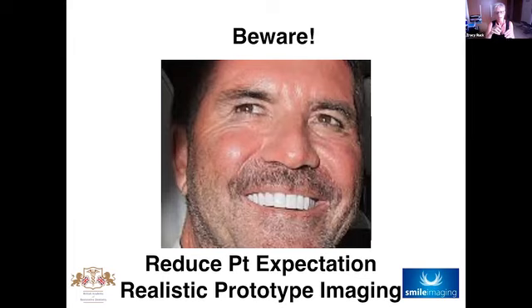And then if they don't like the whitening photo, we can image them with veneers and explain to them what's involved with that. But it's much better that we give them the prototype smile for them to decide if that's correct, and we've got a patient that is aware, rather than doing the whitening and having an unhappy patient at the end of the whitening treatment because the teeth didn't come out as white as Simon's, for example.